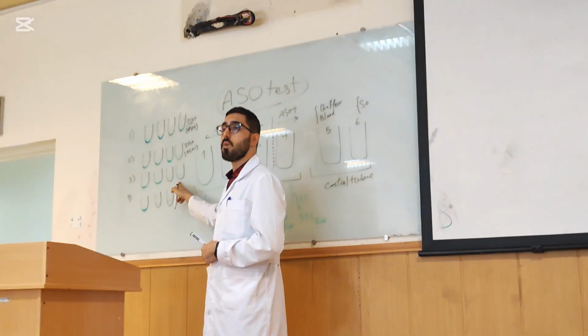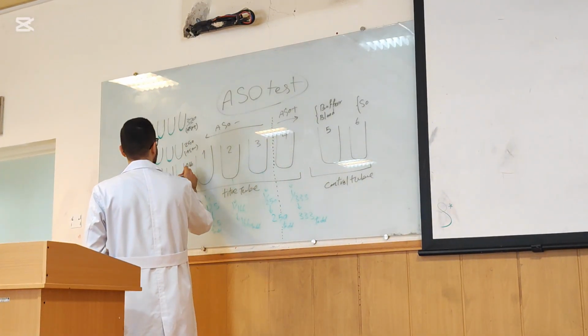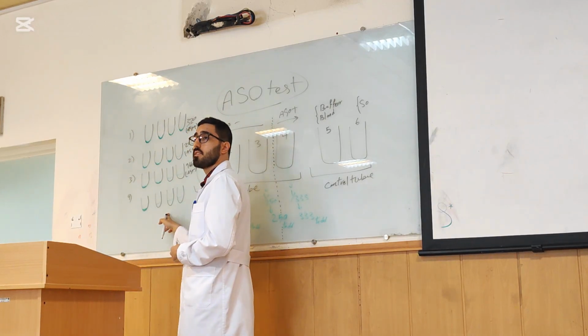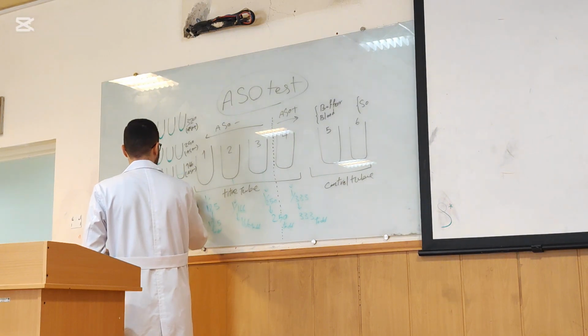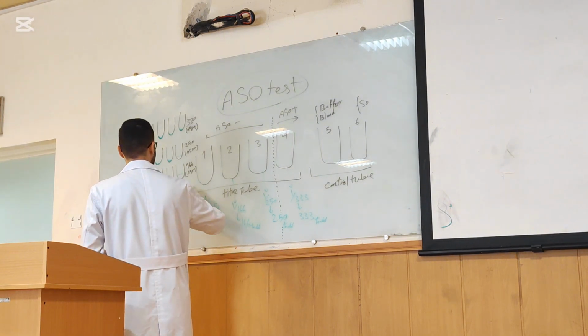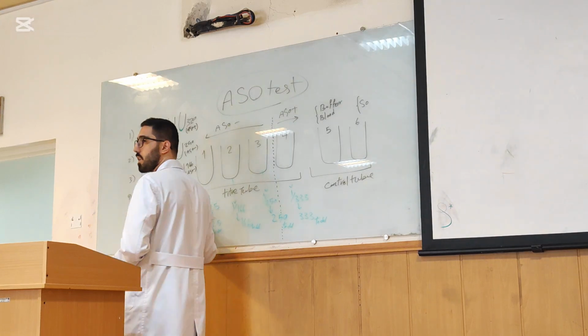166. Okay, and ASO, the last one: positive or negative?